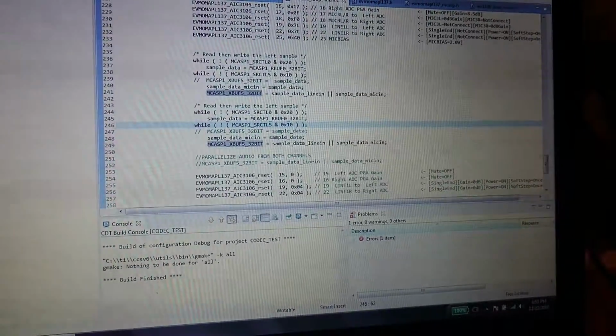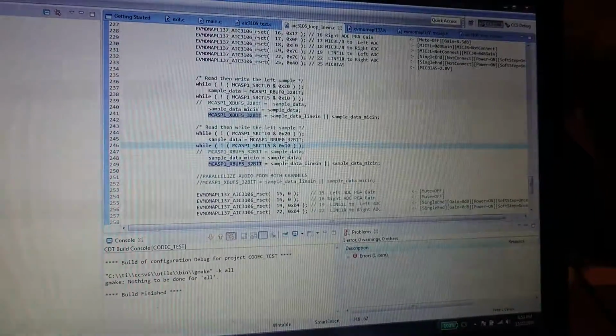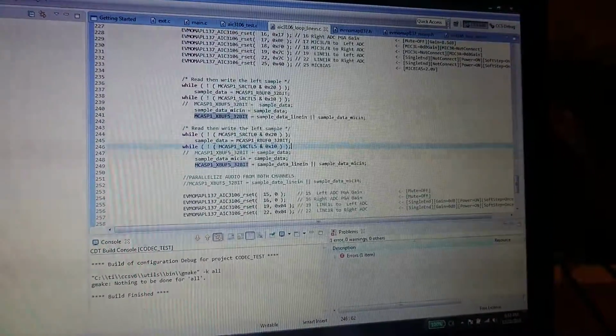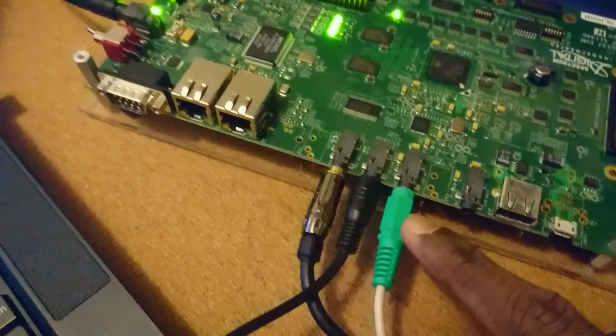So the negative thing about this is, when I take the audio input, the heartbeat sound, from the line in or mic in separately and try to play it through headphones, it plays well because the gain is sufficient. But since now I'm trying to get the two inputs parallelly and manipulate them and produce the output, and just see what comes out, here I'm successfully able to get the signal out, but the problem is the level of the signal coming out of the headphone is very less. The one on the green connector coming out to the headphone out is really very less.